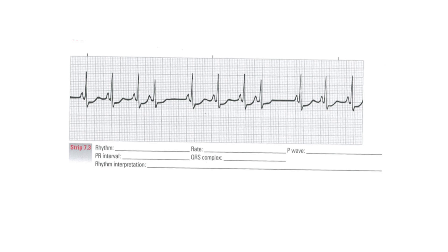In 7.3, this rhythm is primarily regular except for some premature beats that make it irregular. The rate is 94. When doing the rate, you look at the R to R's and use your small box conversion table. There are P waves, so they are sinus. The PR interval is 0.12 to 0.14 - measured right in front of the P to the QRS. The QRS is normal - measured from the beginning to where the S wave comes up to the isoelectric line, about two boxes. The rhythm interpretation is normal sinus rhythm with two PACs.